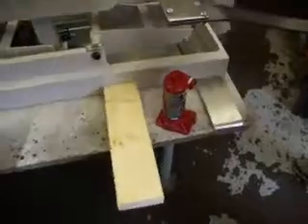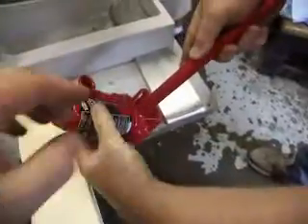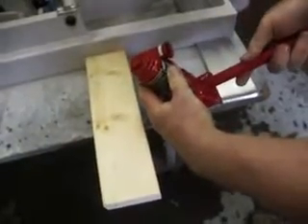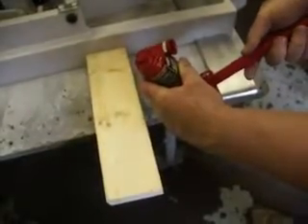First step, we're going to take the floor jack and make sure that the relief valve in the floor jack is completely closed and turned clockwise. Closed and tight. Again, closed clockwise.